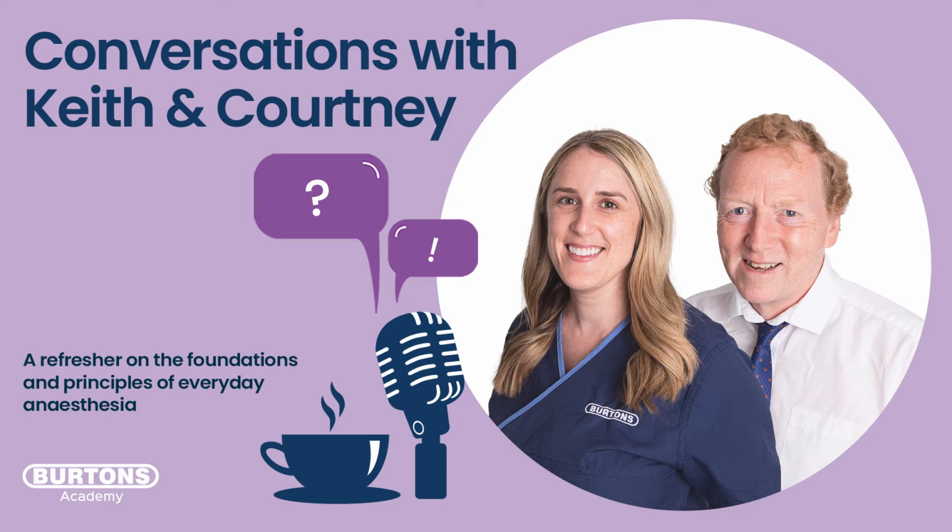Is it underventilating? In other words, should we just give it an extra puff on the bag, fill up its lungs, and actually get rid of some of that CO2? And if that's not curative, is there an underlying reason why it's hypoventilating? Is the anaesthetic too deep? Is there some other cause? Is there blood loss? What else is going on?